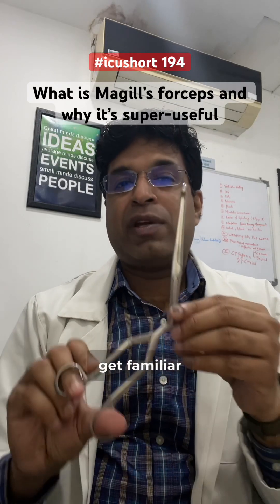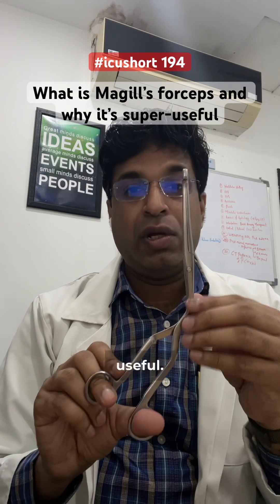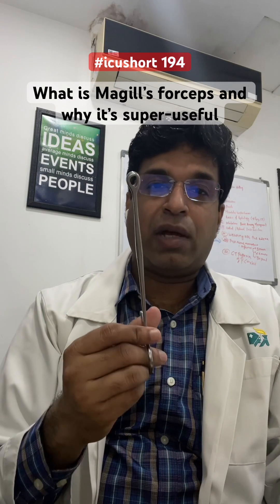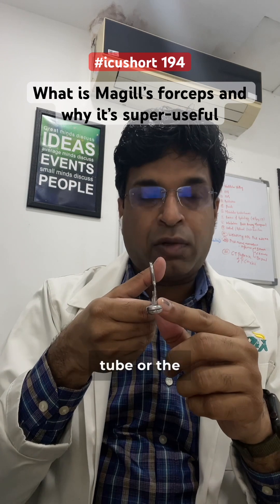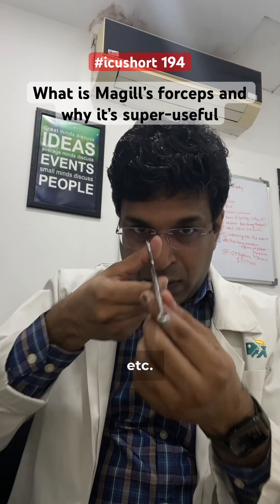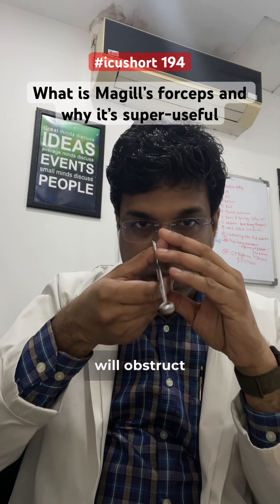Everybody who is working in the ICU should get familiar with McGill's forceps, which is very useful. To understand the beauty of this, you need to see a routine forceps. If you use a routine forceps to mobilize the nasogastric tube, the endotracheal tube, or remove packings, your thumb and hand will come into the vision and you will obstruct the vision.